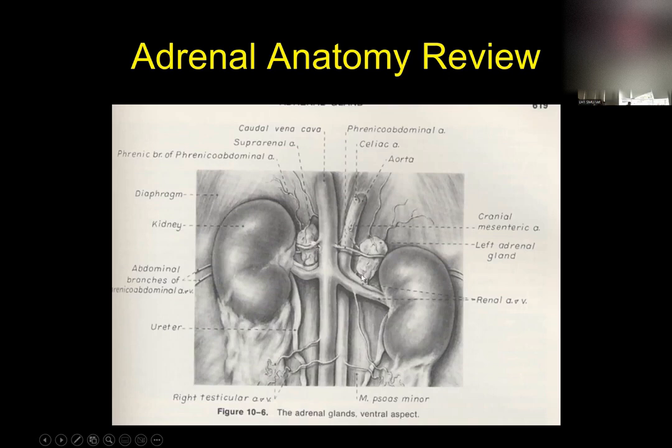If you don't find them in that area, that's typically 90% of them, that's where they live. Sometimes they live up more cranial. Sometimes they'll live down here. Every dog doesn't read the book. But most of the time, that's where they are. So you can find them by learning vessels, names of branches of vessels, looking in hooks and cracks and everything else, or you can find the kidney and go medial to the kidney. That's how I typically find them.